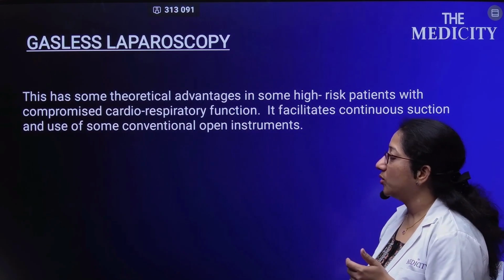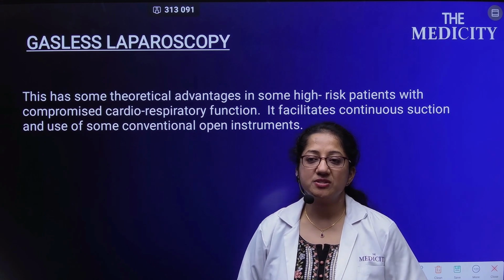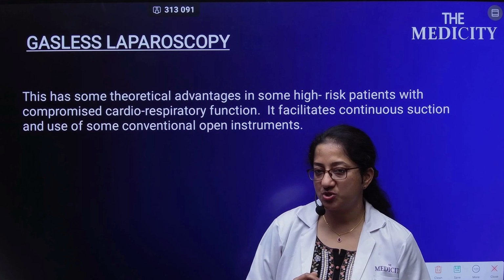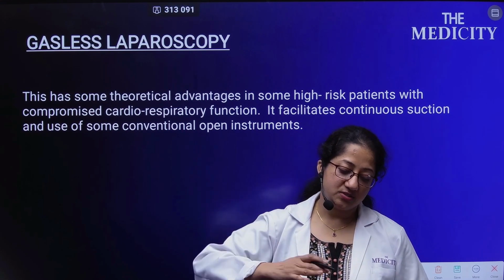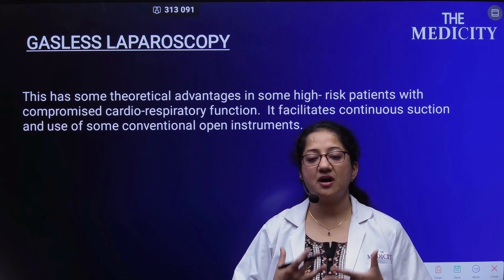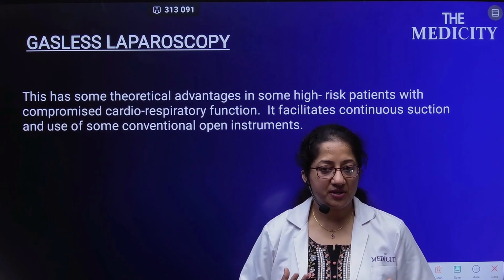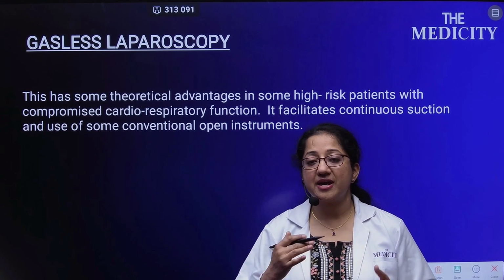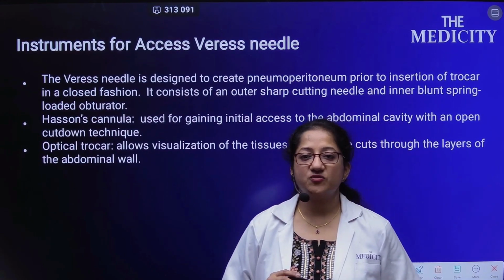Now there also have been some researches on gasless laparoscopy. That is a theoretical advantage in some high-risk patients with compromised cardiorespiratory function. So whenever we do a head-low position for a patient in the OT, the anesthetist keeps telling us, bas karo, bas karo. Why? Because the more we do a head-low posture for the patient, lungs are compressed, the heart is compressed, especially if the patient is obese or old, then the heart rate, the respiratory rate and the SpO2 get affected. So in a few cases, gasless surgeries can be done, but this is more of a theoretical thing than practical.